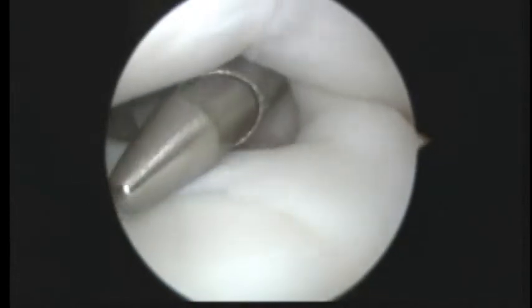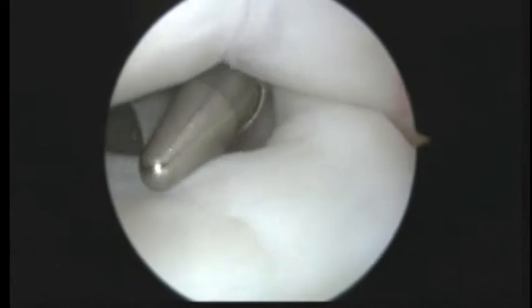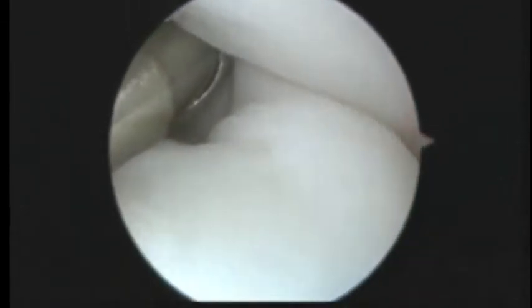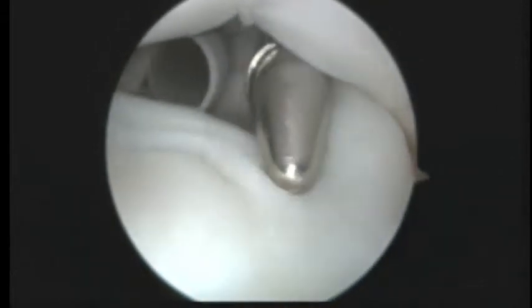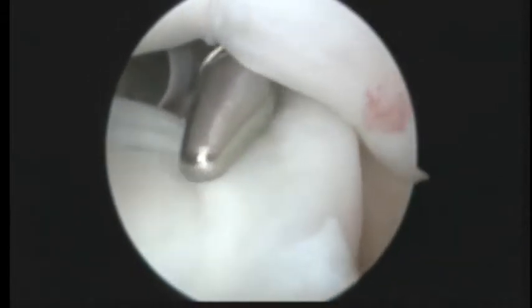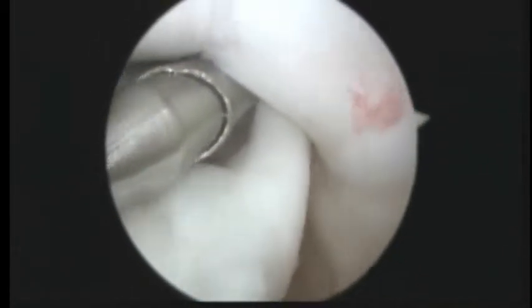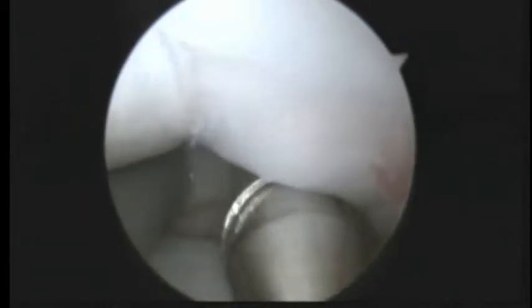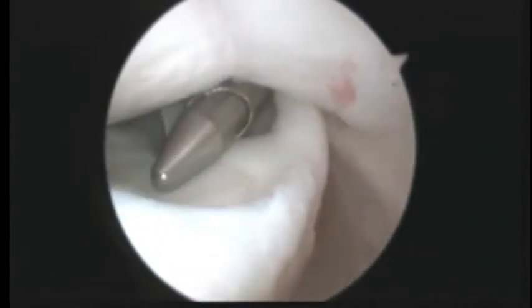There's a little bit of a foramen right at the tip of the metal cannula, but that's normal. Okay. And that actually looks pretty good. So the rotator cuff tendon is at the top of the screen above the metal cannula, and that looks really good. No signs of any problems there.